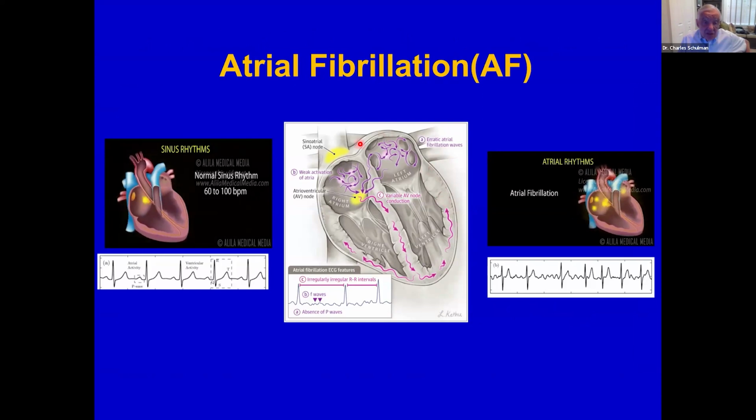So this shows the difference between sinus rhythm and atrial fibrillation. This illustrates normal conduction with sinus rhythm on the ECG, and with atrial fibrillation, there are upwards of 360 fibrillatory waves and reentry circuits that spread and bombard the AV node in an irregular fashion. And so there's variable penetration into and beyond the AV node, which is what gives you the irregular rhythm.